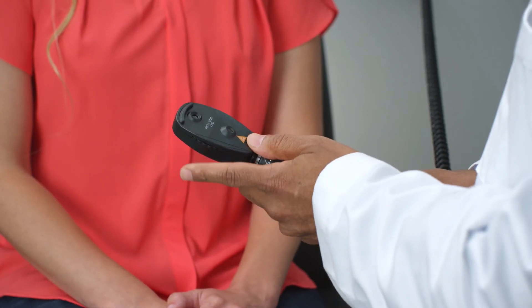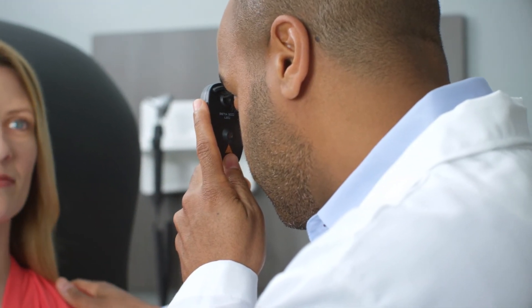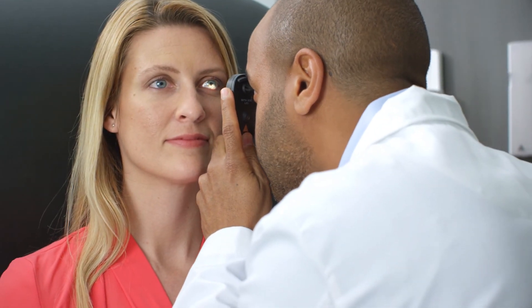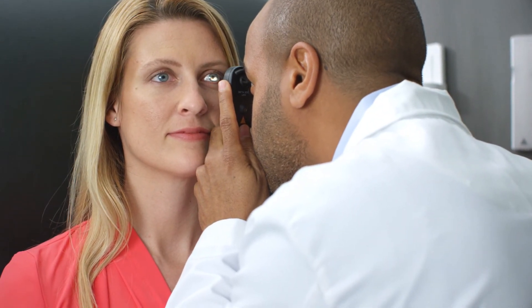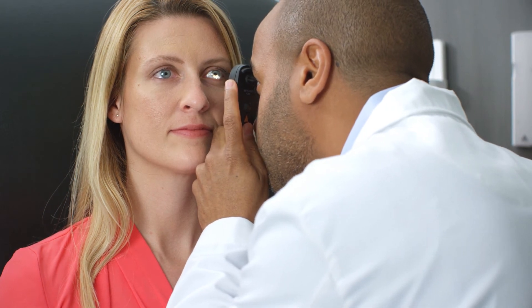Position your thumb in the indent and your finger on the focusing wheel. Bring the instrument up to your eye and stand approximately arm's distance from the patient. Shine the light into the eye you wish to examine and look for the red reflection in the pupil. At this point, with the Beta 200 ophthalmoscope, there are a few things to note that will be different than using a traditional ophthalmoscope.